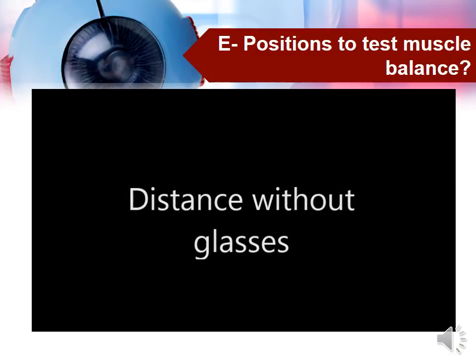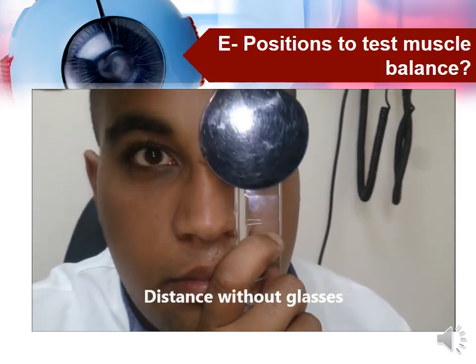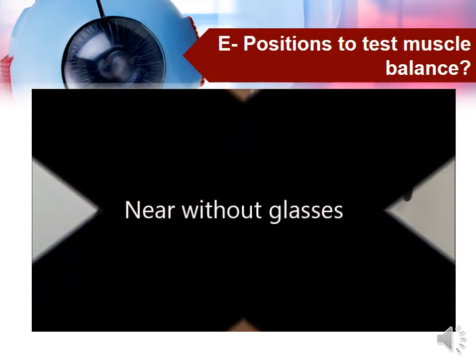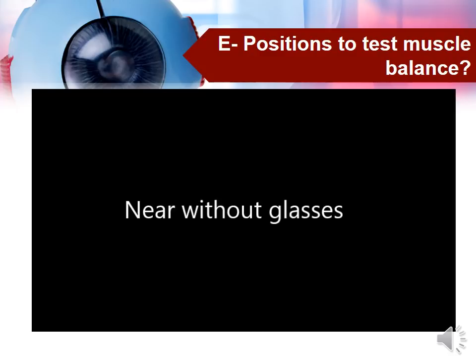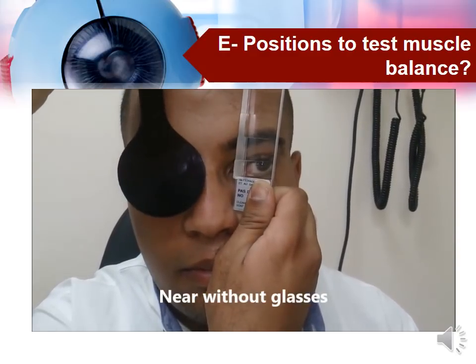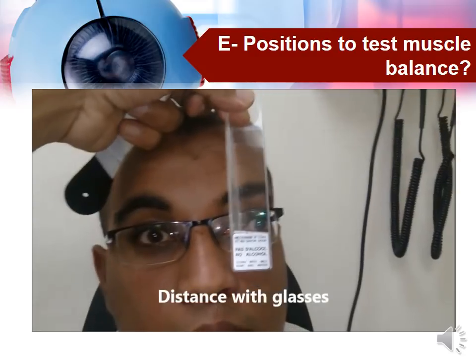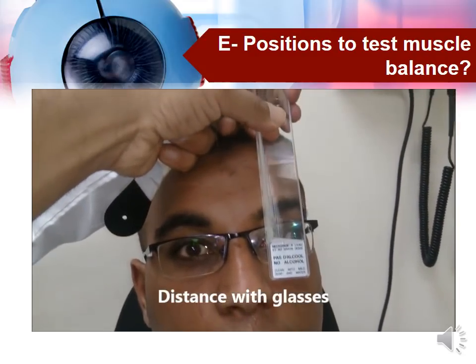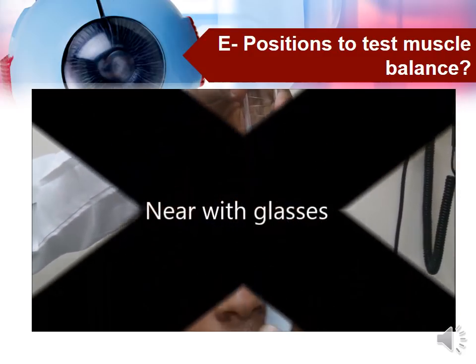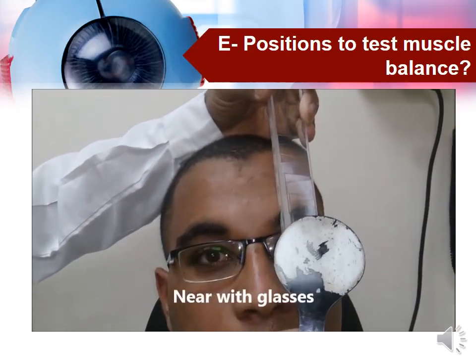This is an example to summarize how we are going to measure the angle. We start with the distance without glasses. Then for near using an accommodative target without glasses. Then for distance with the glasses on. And then for near using an accommodative target with the glasses on.